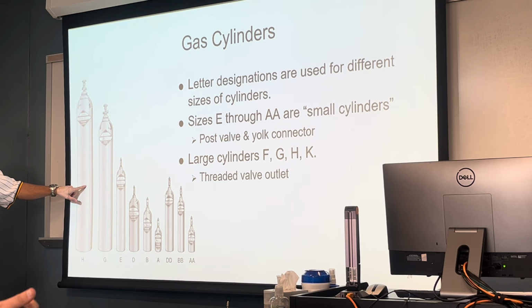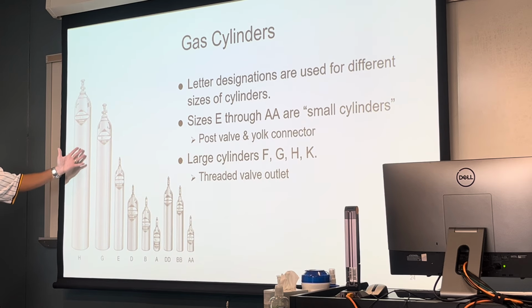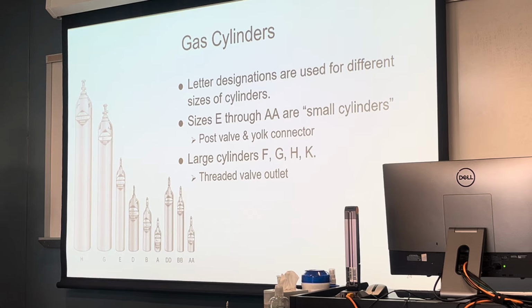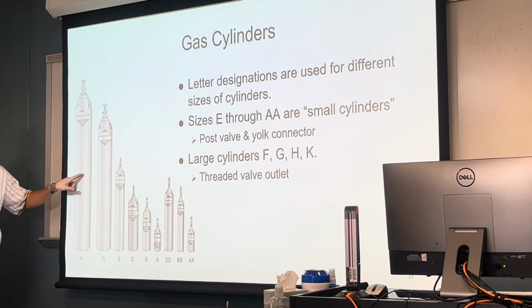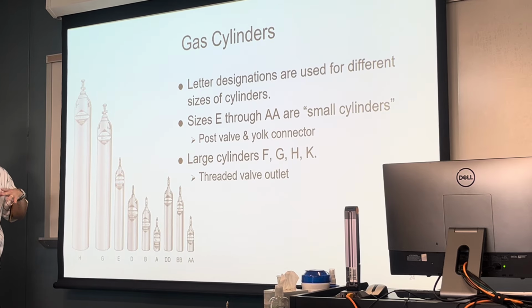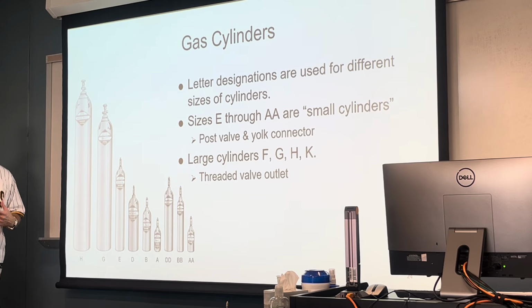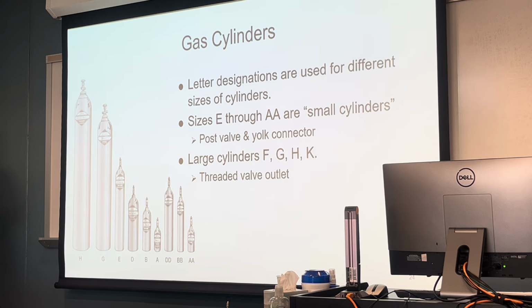And when it happens, because it's such a large, heavy tank, it's all hands on deck to get ready to set these up, making sure every single room has one, especially the patients on ventilators who are going to need a lot more oxygen, as opposed to patients just wearing a nasal cannula at 2 liters.